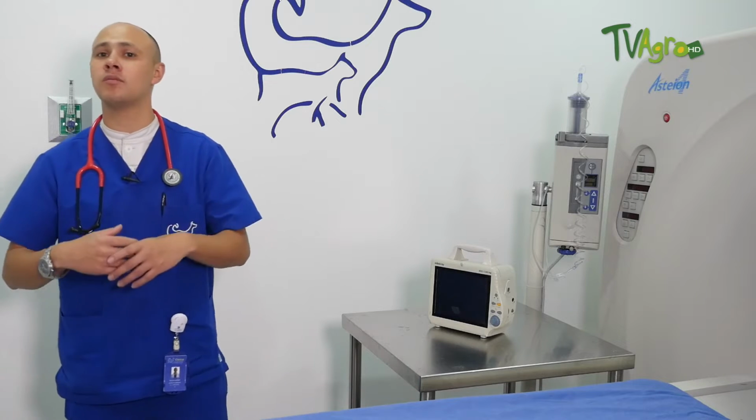We can make head studies, spine, abdomen, thorax and bones. We have a team that can generate a very high image quality. In this machine we can introduce patients of all kinds, from a puppy of less than a kilo to animals of 200 kilos. The idea with this type of study is to generate an accurate diagnosis, for example, if the patient has an intra-abdominal tumor.